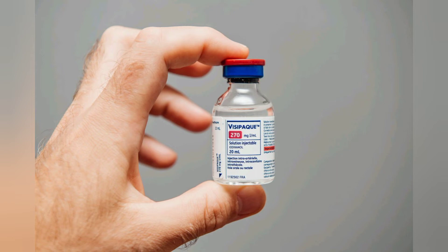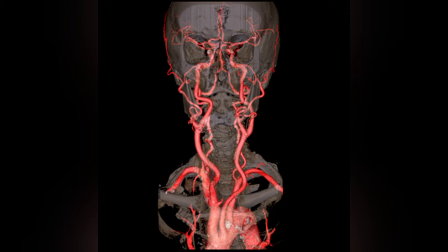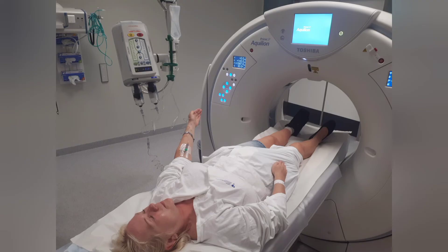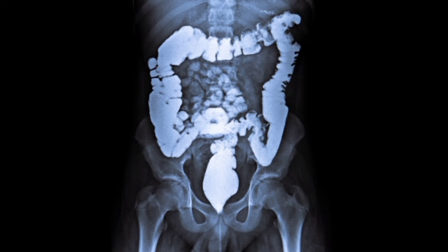Iodine-based contrast substances are used for the circulatory system, as they are very good at stopping X-rays. As they spread through the blood vessels, on X-ray emission they illuminate the blood vessels in the CT image. These are given through an IV line.